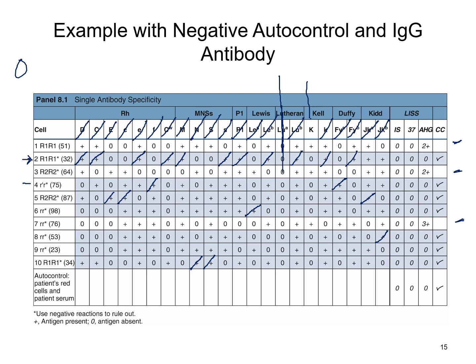This is just my way that I do it. Labs do this differently, so someone else could teach you differently. I just rule out with a line down. Typically we don't run all the way through the panel. I just did that for a demonstration here. Oops, erased something I shouldn't have. I usually just keep it simple and I just do this. That way I know that I ruled it out on probability. Which leaves us with just Kell.